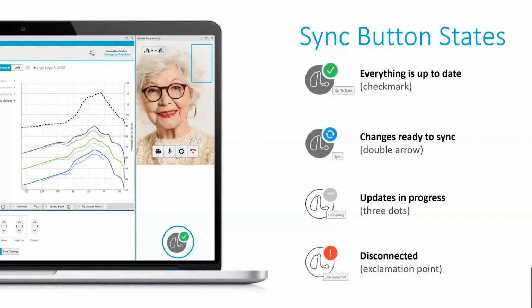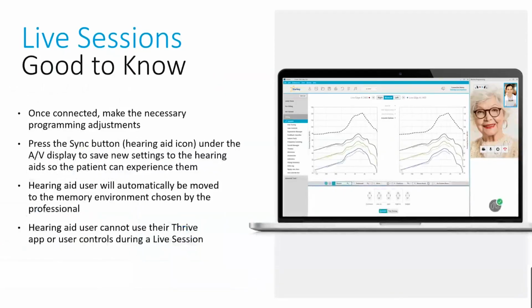Okay, so as a reminder, that sync button is incredibly important. Anytime you see the green check mark, you know everything is up to date and has been sent through to the patient on the other side. If changes are required syncing, then you'll get the double arrow, so you'll want to click to send them through, and it does give you the three little dots to let you know that the update is in progress. Do keep in mind if you get the red notification, that's an indication that you have a disconnection. So that sync button is incredibly important to lock everything in place.